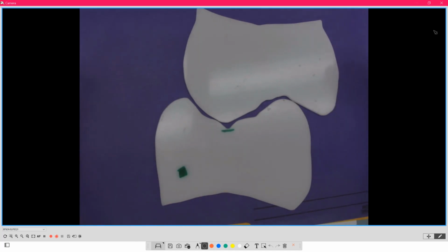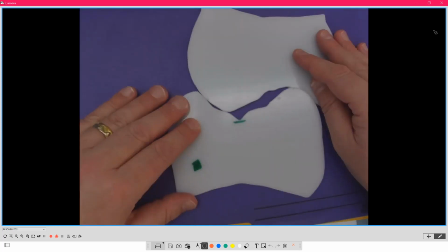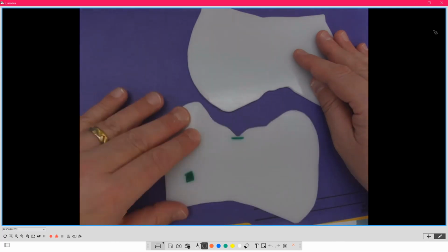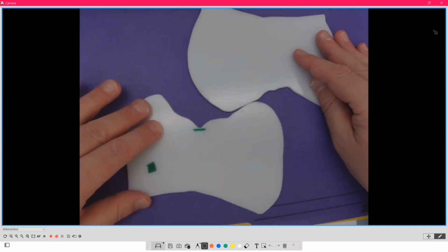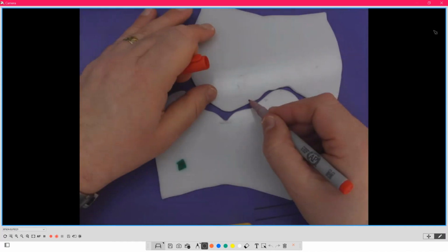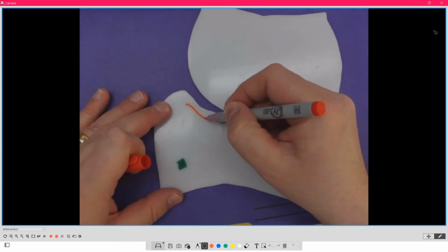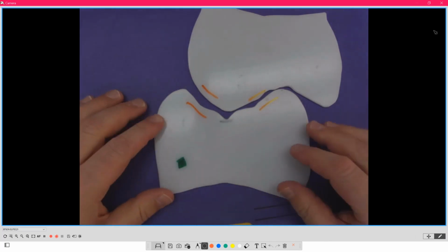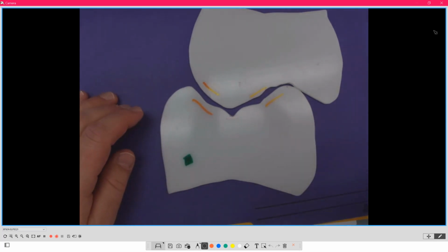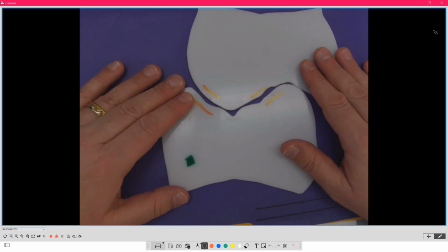That does not work like that in real life. What happens in real life is the patient is chewing on a chew cycle, and that chew cycle varies to that person, whether it's more vertical or more horizontal. And then the risk comes where we line up and we hit the guiding planes here, for example, or here, and it slides into position. So it hits and slides. The patient can't tell you it hits and slides because there's no nerve to the denture teeth. So the hit and slide is what's causing the damage.